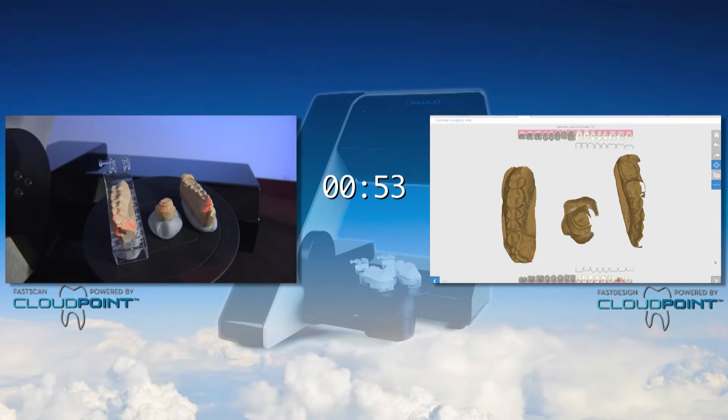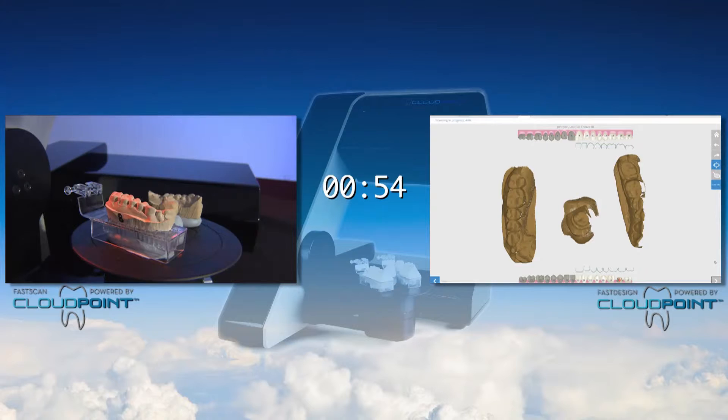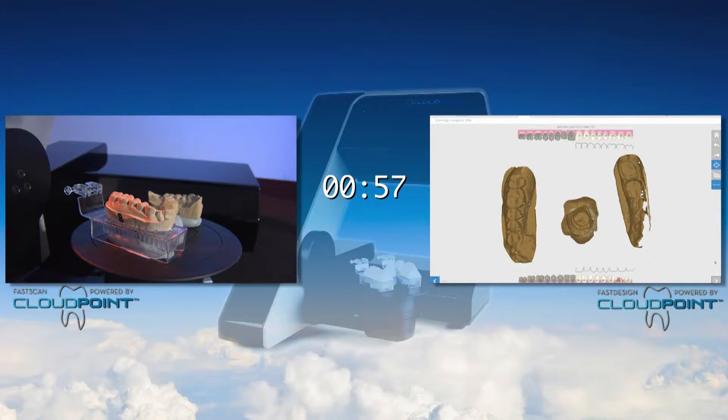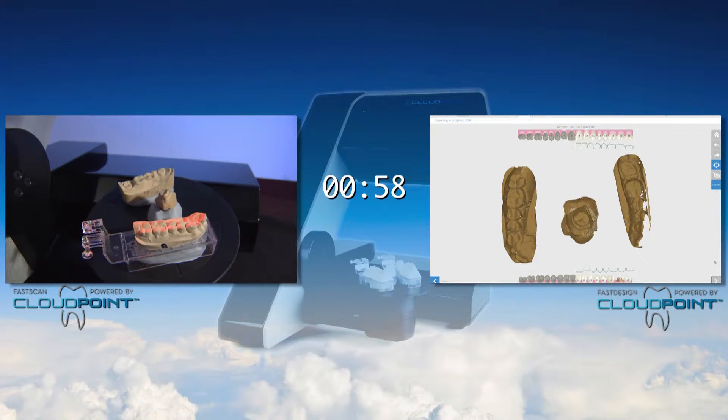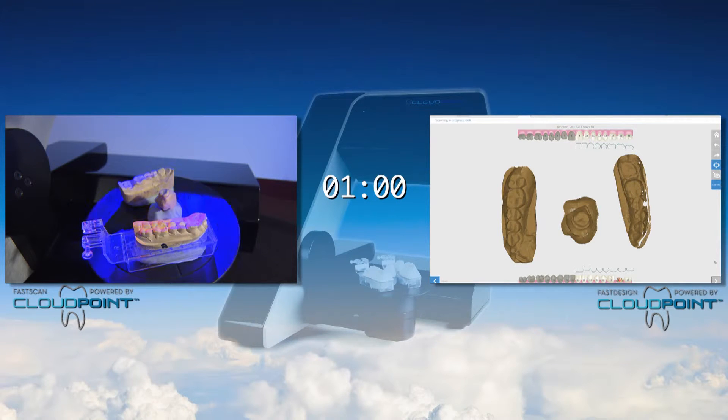Scans are taken in nine different positions to ensure that all of the necessary data is collected, especially within the interproximal contact areas.